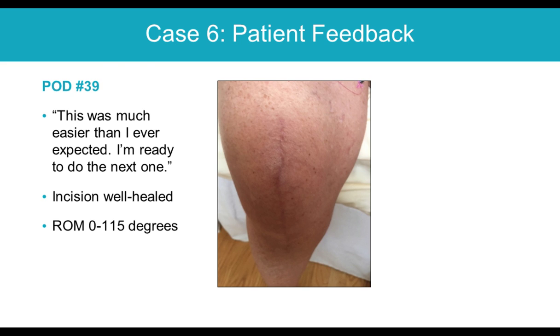Her incision was well healed. She had range of motion that was acceptable for this early time. And when she came back at about 5 to 6 weeks, she said this was much easier than expected. She's ready to do the next one. She's got motion from 0 to 115 degrees without any incisional problems.